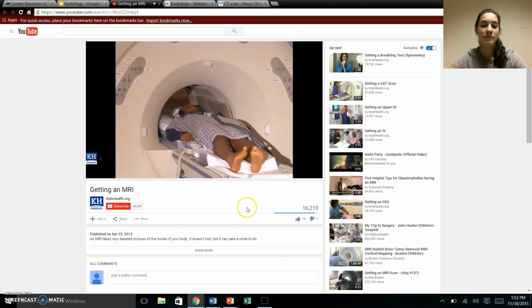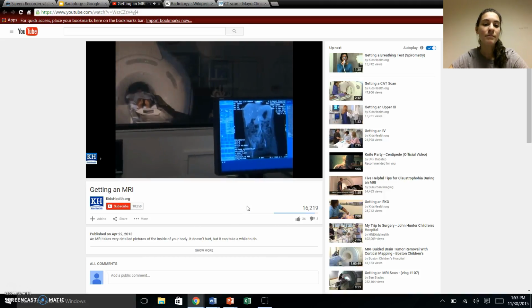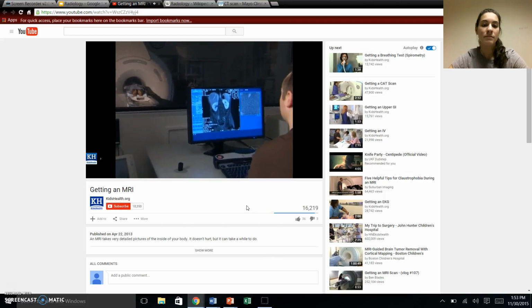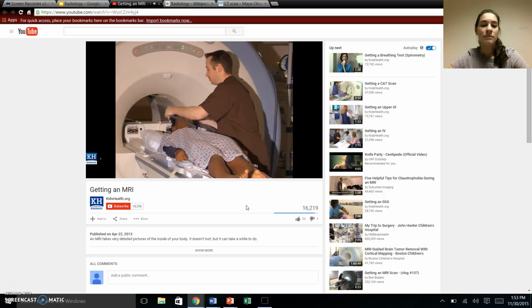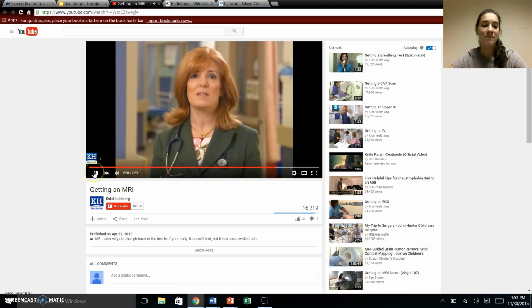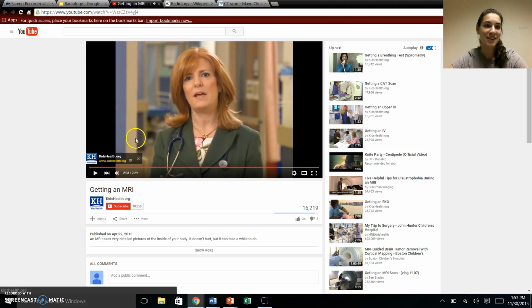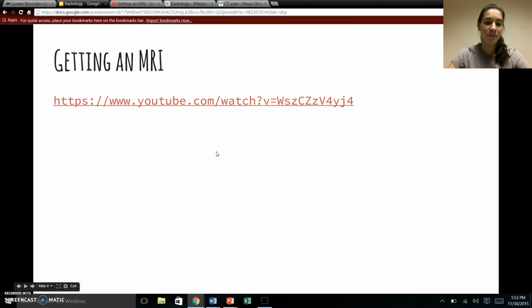Even though you may feel alone, you're not. The tech will be watching and listening to you for the entire test. You're doing a great job, Sierra. We'll be done soon. When you're done, the tech will slide the table out of the tunnel. And that's it. MRIs may seem scary, but they don't hurt. Alright, so that is your MRI.